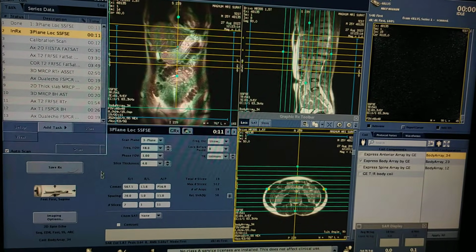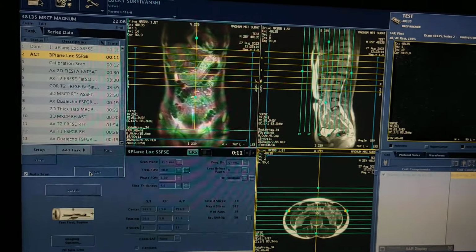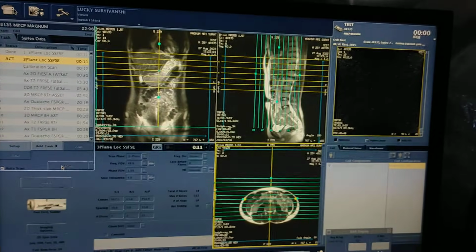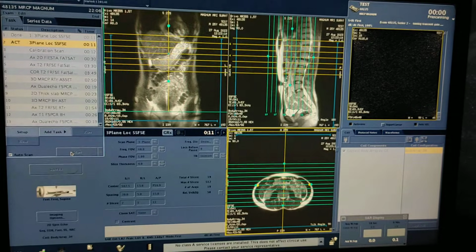Now I will relocalize. Sometimes there is no need to relocalize. You can scan on this scanner also.